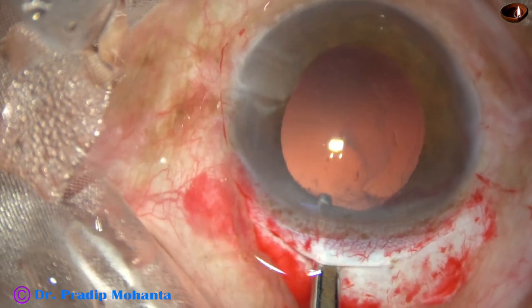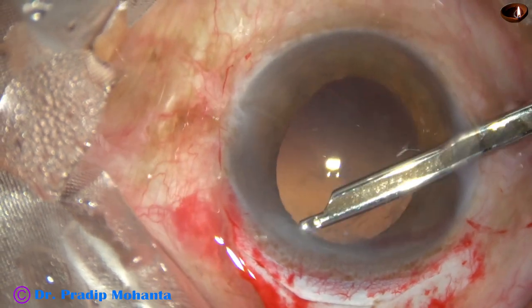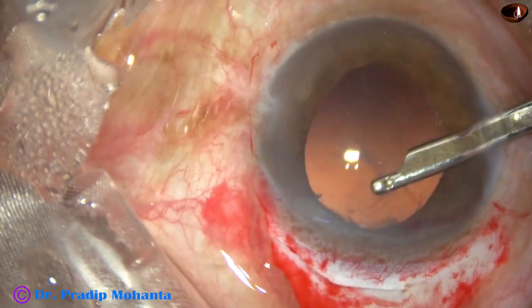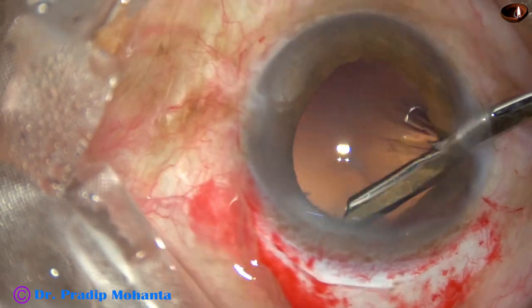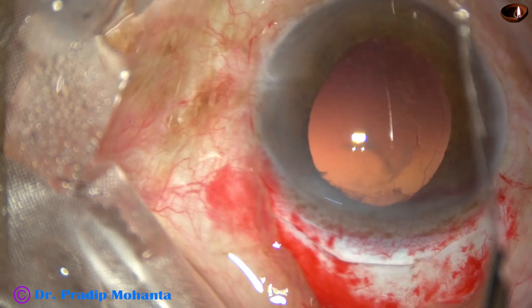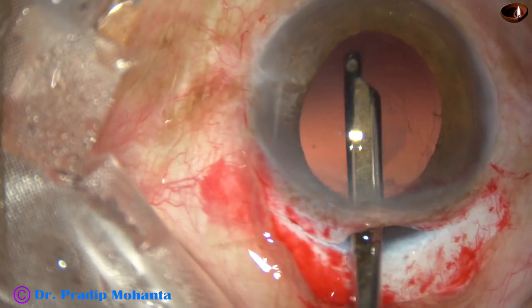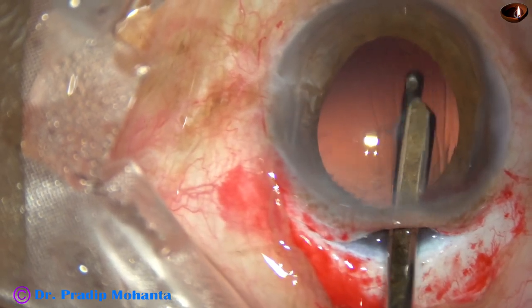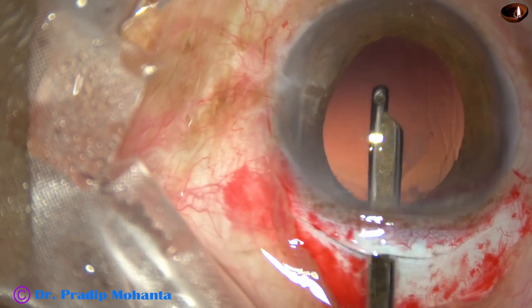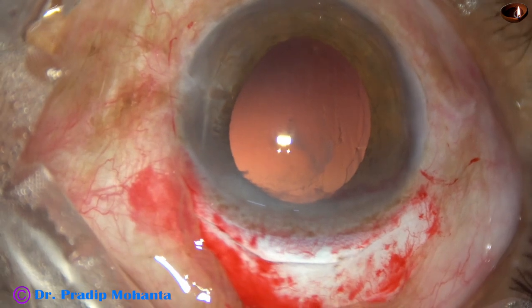Ultrasonography B scan was done, and the retina was attached. There was no echogenicity in the vitreous cavity. So cortical cleaning and polishing of the posterior capsule is done nicely. Some cells are seen sticking to the posterior capsule at some areas, that is nicely removed.